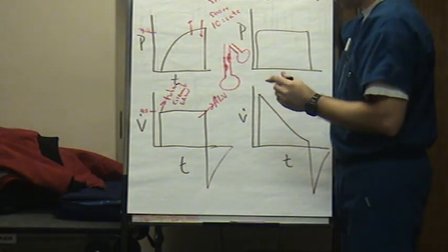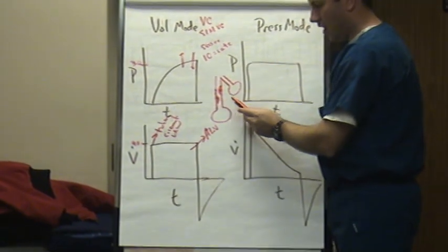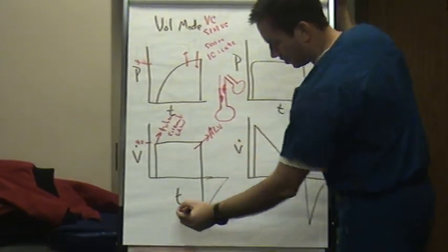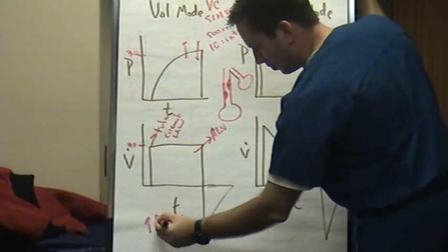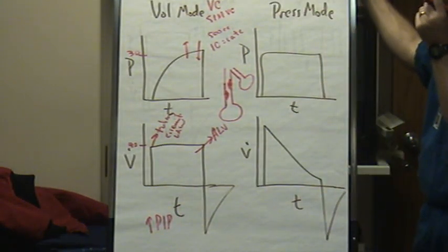And that's exactly how we know that that is going on. When your peak pressures are climbing, that means we're seeing some resistance down here, maybe a disease process. And we'll typically see a higher pressure. You already mentioned that. So we'll have an increase in your PIPs. PIP stands for peak inspiratory pressures. So you'll have an increase in your peak pressures on your vent.